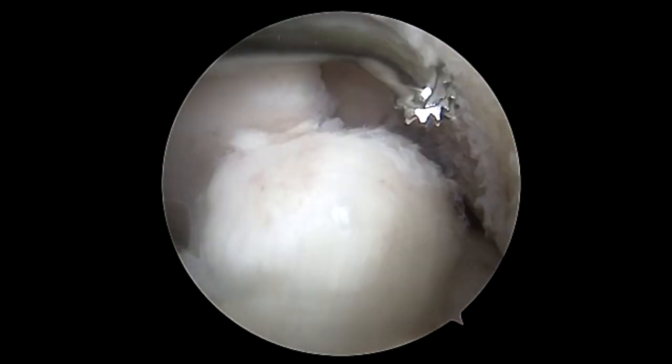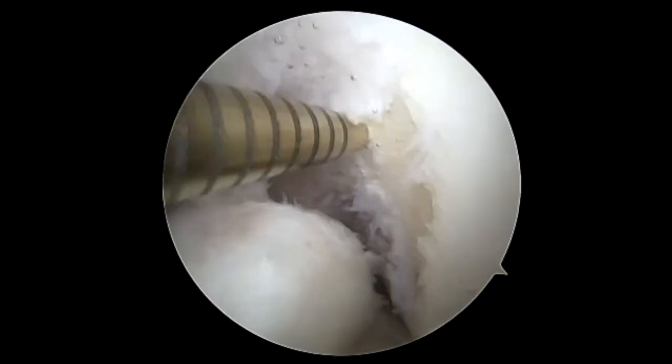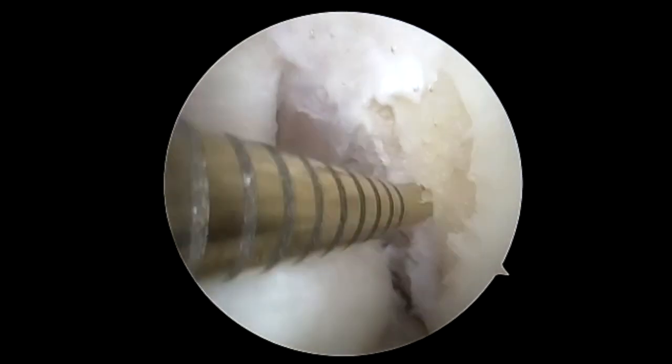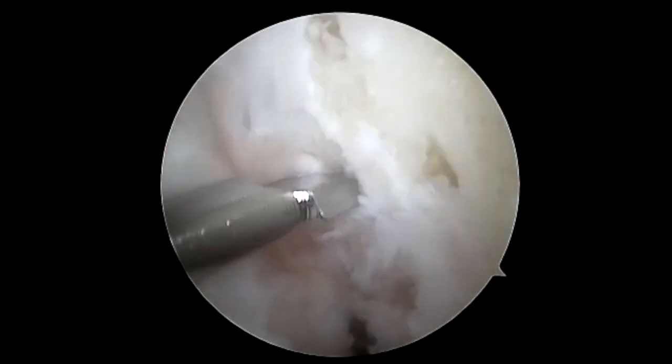We're starting to debride this area. We debride the wall femorally, and then we're going to micro-fracture the femoral wall to stimulate healing. In the area of entry, we'll make a slightly larger micro-fracture hole.